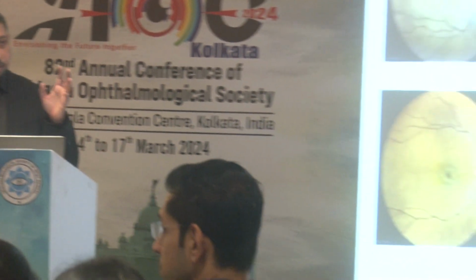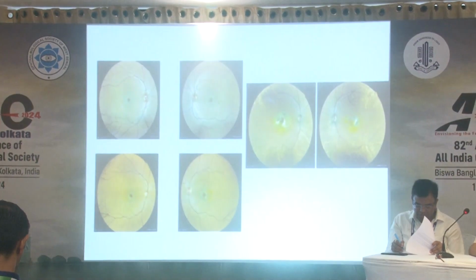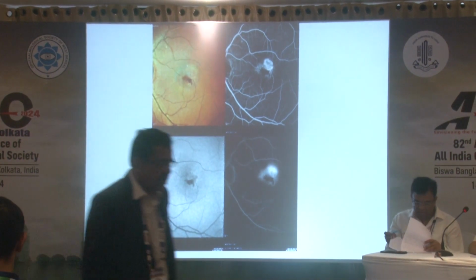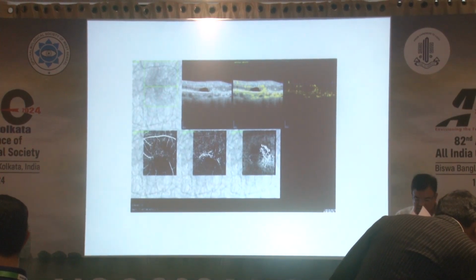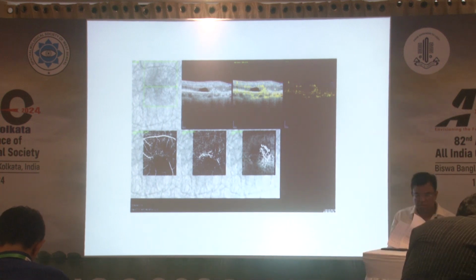So I'll be talking about the outer retinal microvascular changes in MACTEL. We all know that MACTEL you can diagnose quite easily, initially through various phases, graying of the retina, then obvious pigment changes, and then finally a CNVM. And this is how a CNVM would look like. You have the typical early change of the CNVM and late leakage with the heme on the color photo. But the crucial detail for diagnosing a CNVM is the OCTA, where you see beautiful networks in the avascular layer.